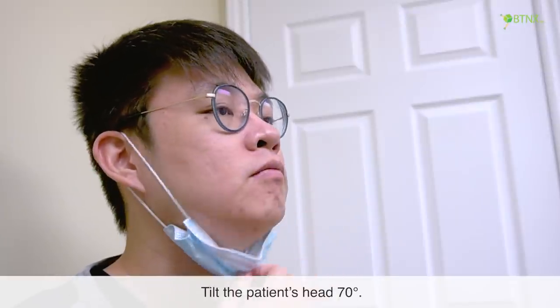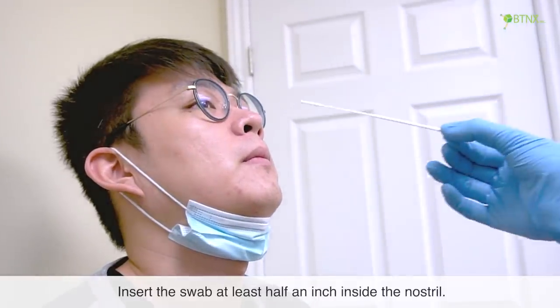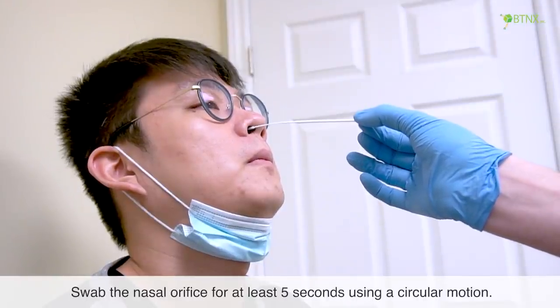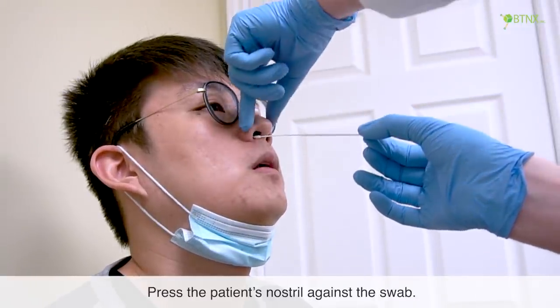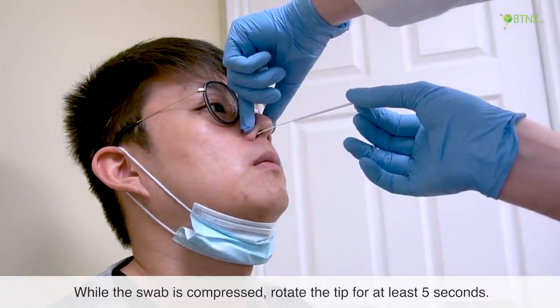Tilt the patient's head 70 degrees. Insert the swab at least half an inch inside the nostril. Swab the nasal orifice for at least 5 seconds using a circular motion. Press the patient's nostril against the swab, and while the swab is compressed, rotate the tip for at least 5 seconds.